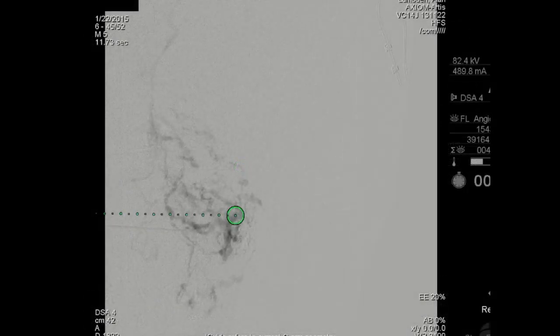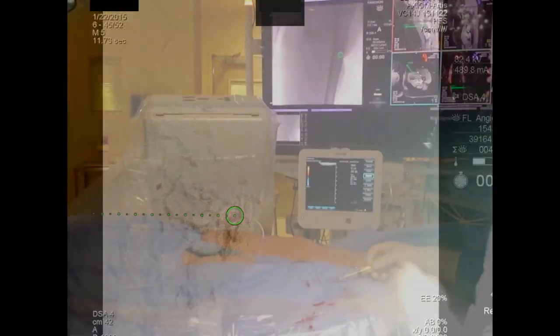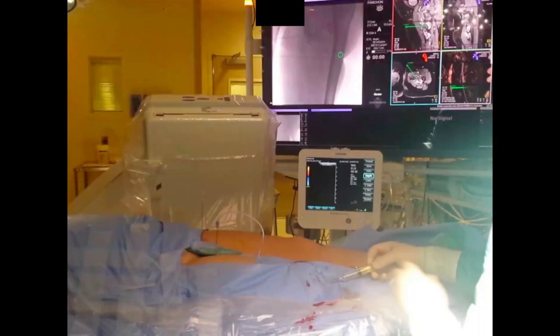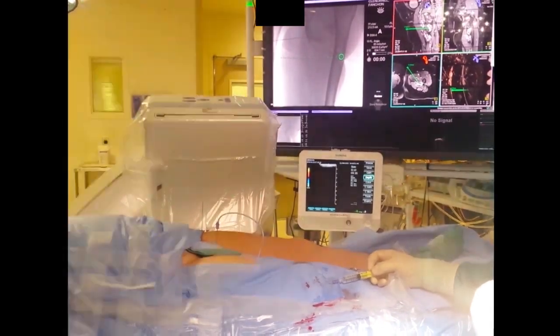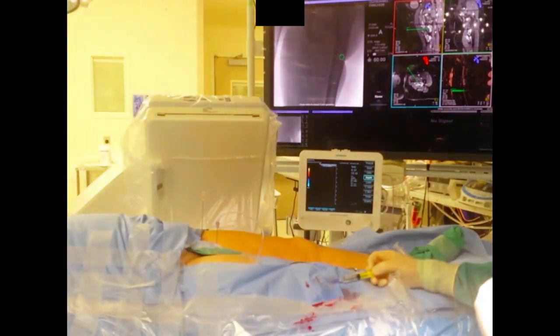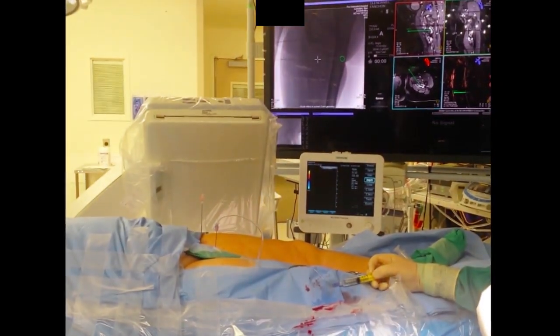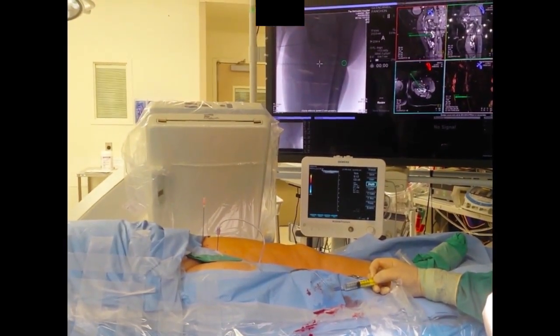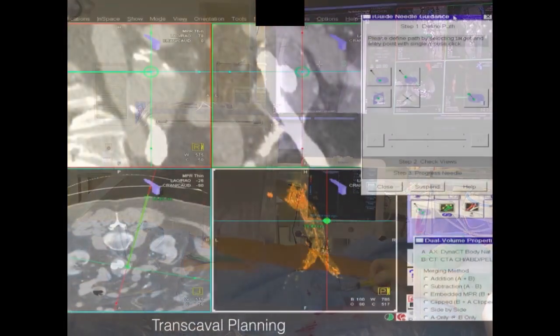This is an example of how this has been used in the thigh — a venous malformation deep in the thigh. So we can use it not only for translombar embolization, but also in the thigh to access things which are really not otherwise visible using ultrasound. You can see the calculation and the path in the background, and then we can inject directly.